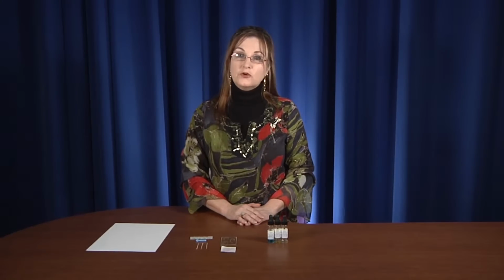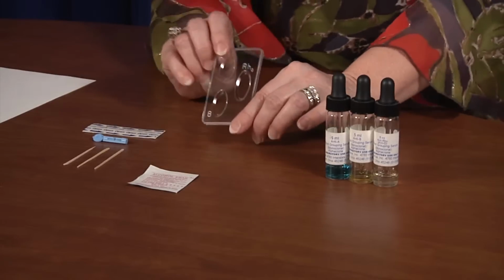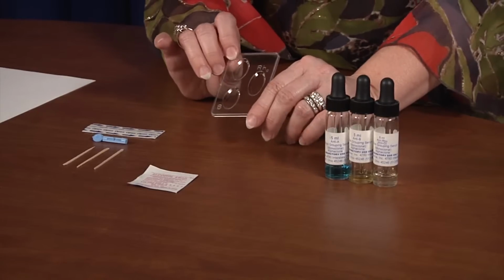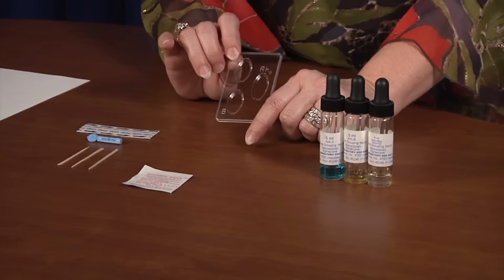In this video I'm going to do a demonstration of the blood typing exercise that you'll be doing in lab with your instructor. Before we begin, I'd like to make sure that you're familiar with all of the pieces and parts that you're going to need to be able to do this. To begin with, you're going to need a tray or a microscope slide. If you have a slide, your instructor will tell you how to mark it and how to use it.